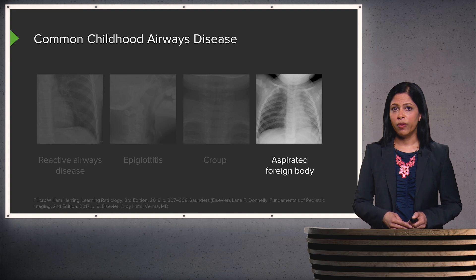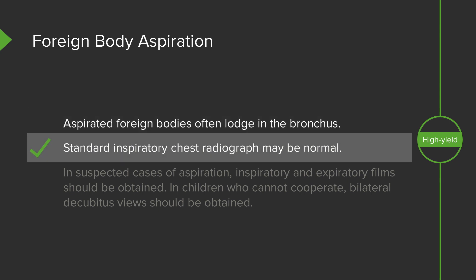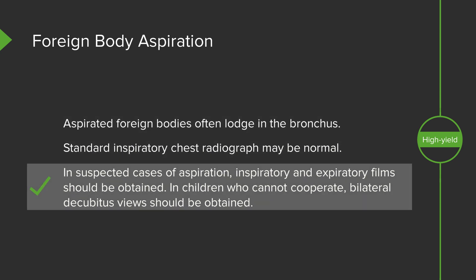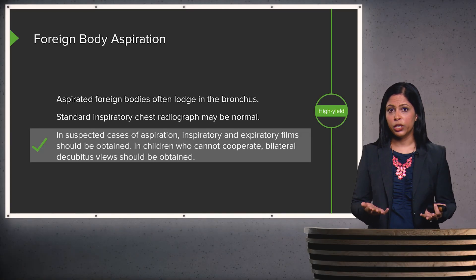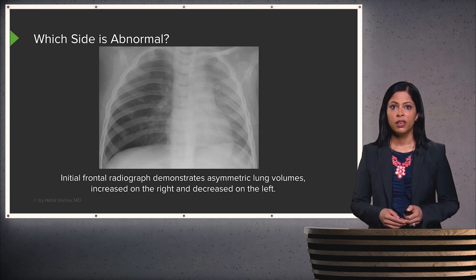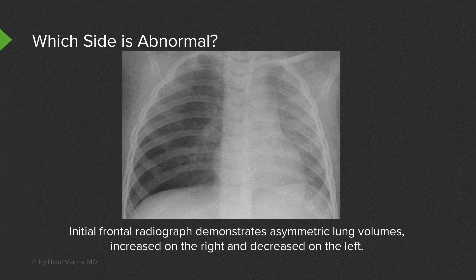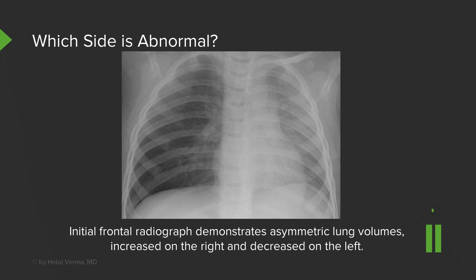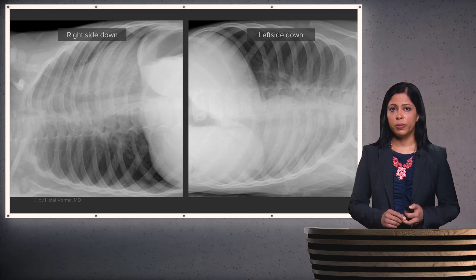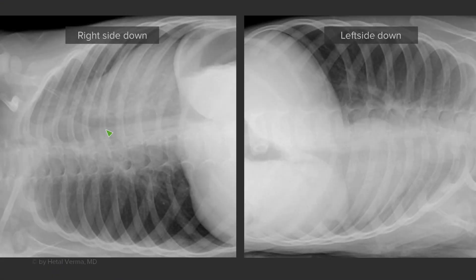Aspirated foreign body is very important to recognize in a child. Aspirated foreign bodies often lodge within the bronchus, and a standard inspiratory radiograph may be normal. In suspected cases of aspiration, you want to perform both an inspiratory and an expiratory film. In children who can't cooperate, you can perform bilateral decubitus views. In this case with a suspected foreign body, the frontal radiograph shows asymmetric lung volumes — volume is increased on the right and decreased on the left, making it hard to determine which side is abnormal. Bilateral decubitus views were performed, with the right side down on the left image and the left side down on the right image.